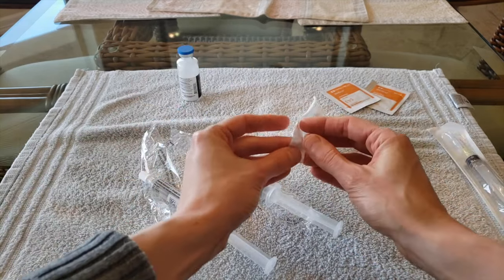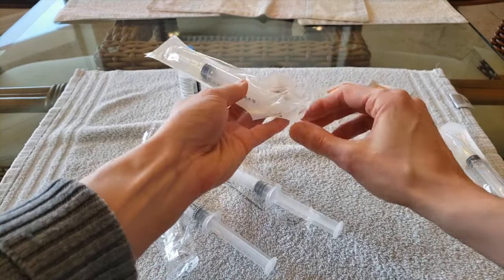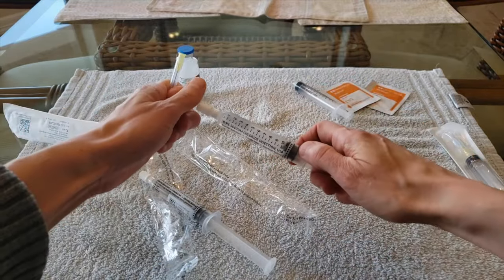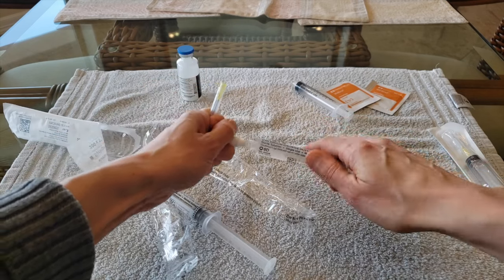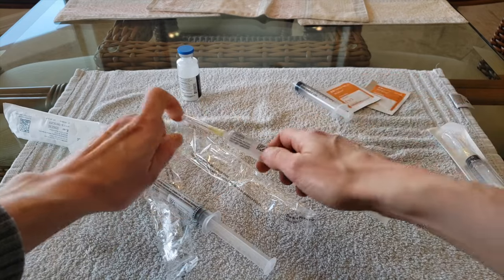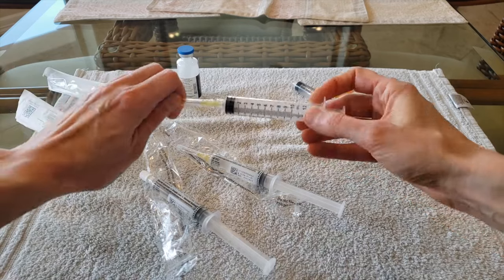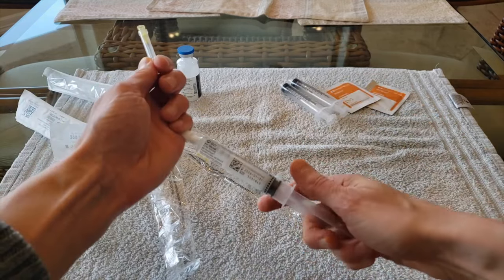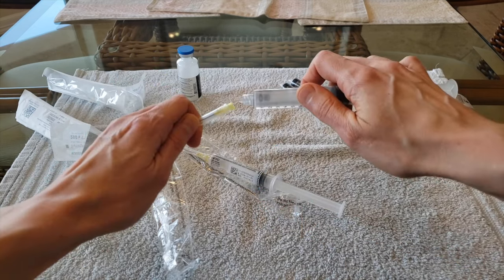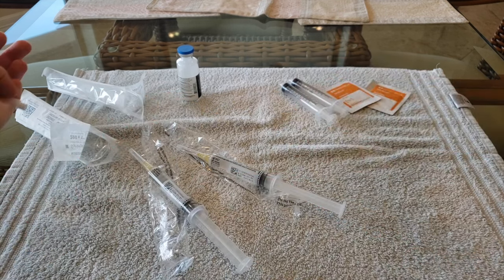Next, I open up a package which has in it a syringe and needle. Since I only need the needle, I remove the needle from the syringe and discard the syringe. I then carefully remove the cap from the saline flush and attach the needle securely, then set down the saline flush. I then pick up the second syringe and needle, repeat the process of removing the needle from the syringe, remove the cap from the saline flush, attach the needle to the flush, and set it down.